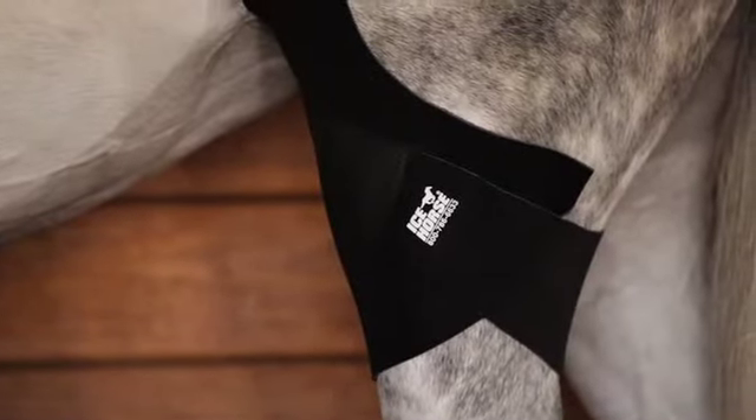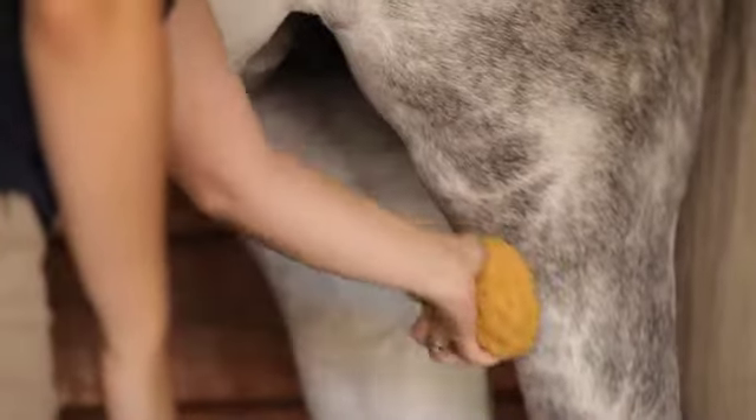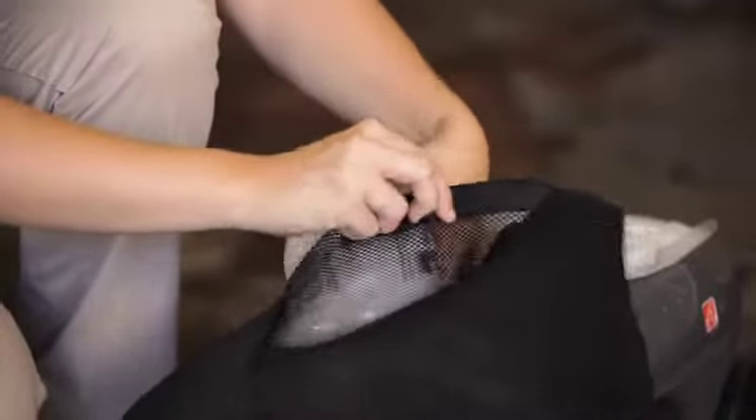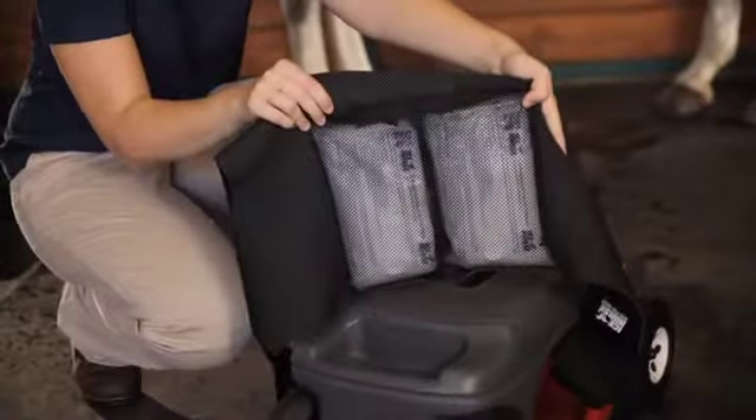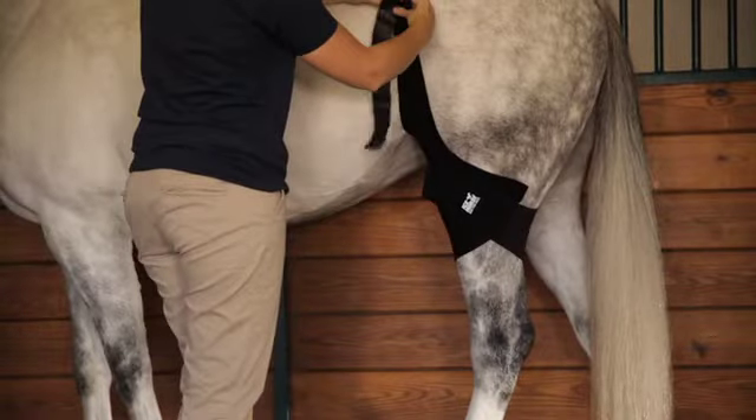Today's Icehorse course shows you how to apply Icehorse cold compression stifle wraps. The First Ice formula stays frozen over two hours, allowing more effective treatment to the hard-to-reach stifle area.